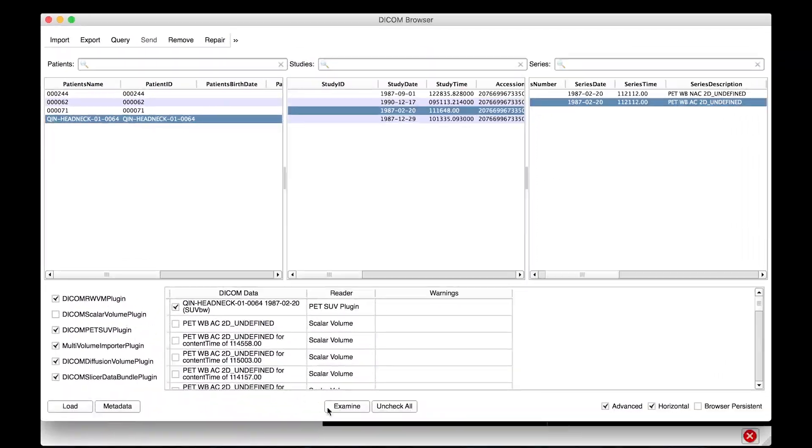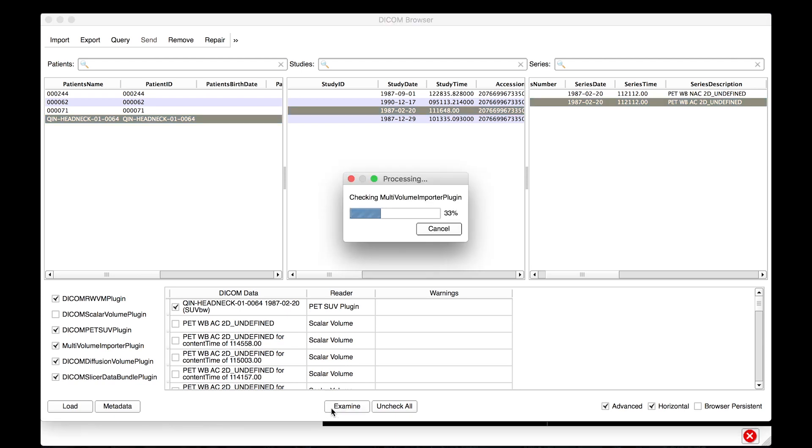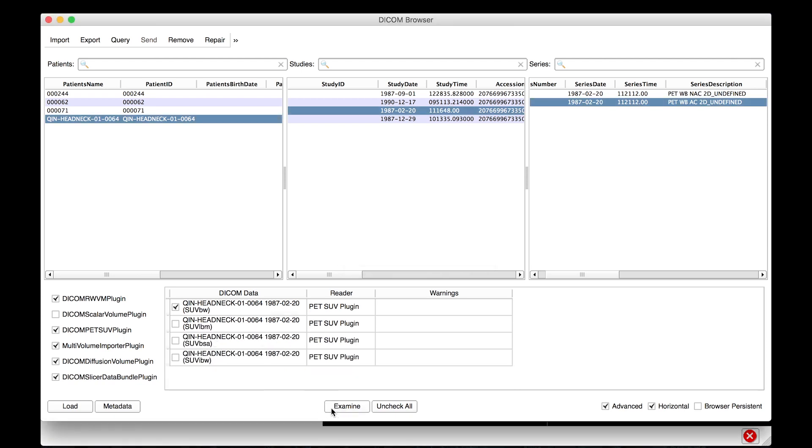By default, the dataset will be loaded as SUV bodyweight normalized dataset. In addition, the tool also supports other SUV normalization variants, like SUV lean body mass, for example. These additional SUV normalization options are only available depending on the information stored in the PET scan's DICOM header.